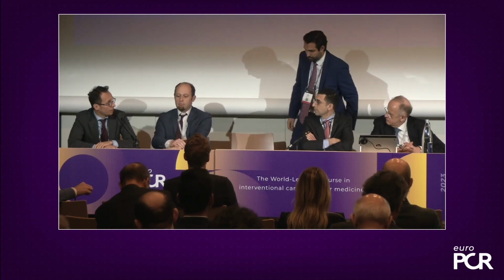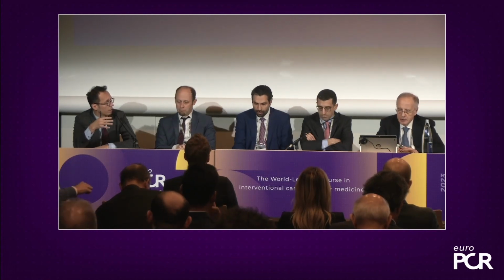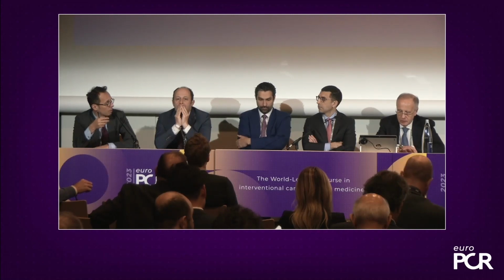Emanuele, it's a good question actually, but I think the major advantage is that whenever you did some of those PCIs with the FFR wire in, you might see that the wires sometimes get destroyed, especially when you do the pullback multiple times. And to have a device where you can just go over the wire has multiple advantages. First of all, the wire itself, the workhorse wire, is not so traumatic and can give you extensive backup as well. You have different subsets of workhorse wires, and so you can guide your pullback, your measurement initially, and also afterwards your PCI, right? So for the post-PCI measurement of FFR, which becomes more and more important in nowadays physiology assessment as well.